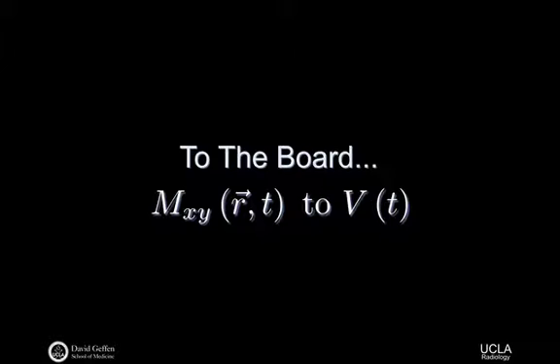And that could, in fact, be a function of space, believe it or not. So when we play an RF pulse, we want to get a certain amplitude, we want to get a certain phase, but the sample that we're imaging combined with the B1 coil that we're using for exciting will give us a phase on our object. That phase may in fact be a function of space as well, hard to know.